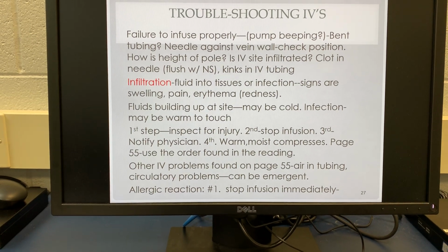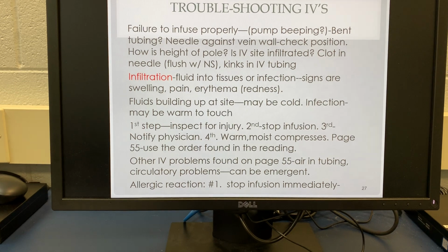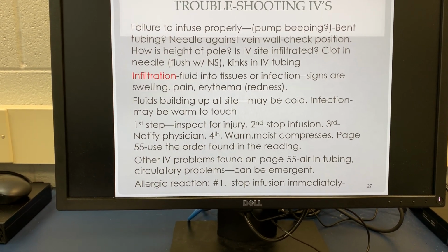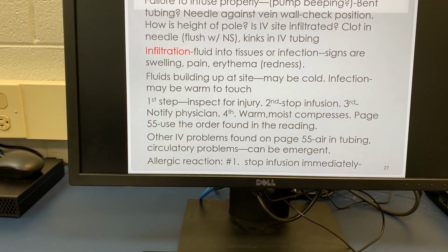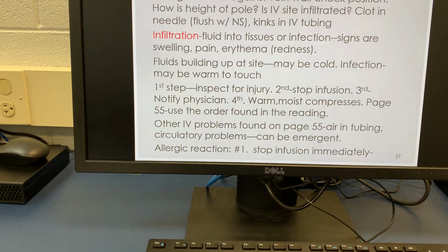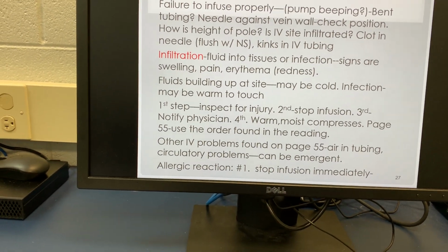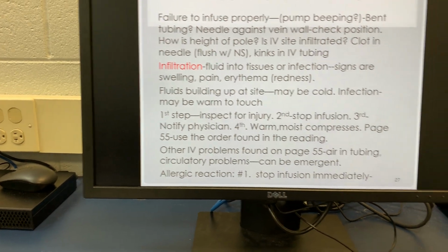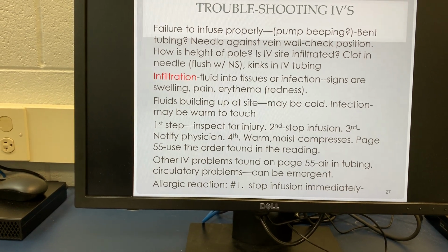Now, if the IV site is infiltrated, you've got a whole other thing going on. You can't continue to put medications into an infiltrated IV, because infiltration means the vein is leaking, and so all that medication is going into the tissue around the site. Veins aren't like a brand new garden hose where it's all nice and rubbery and springy and nothing comes out.